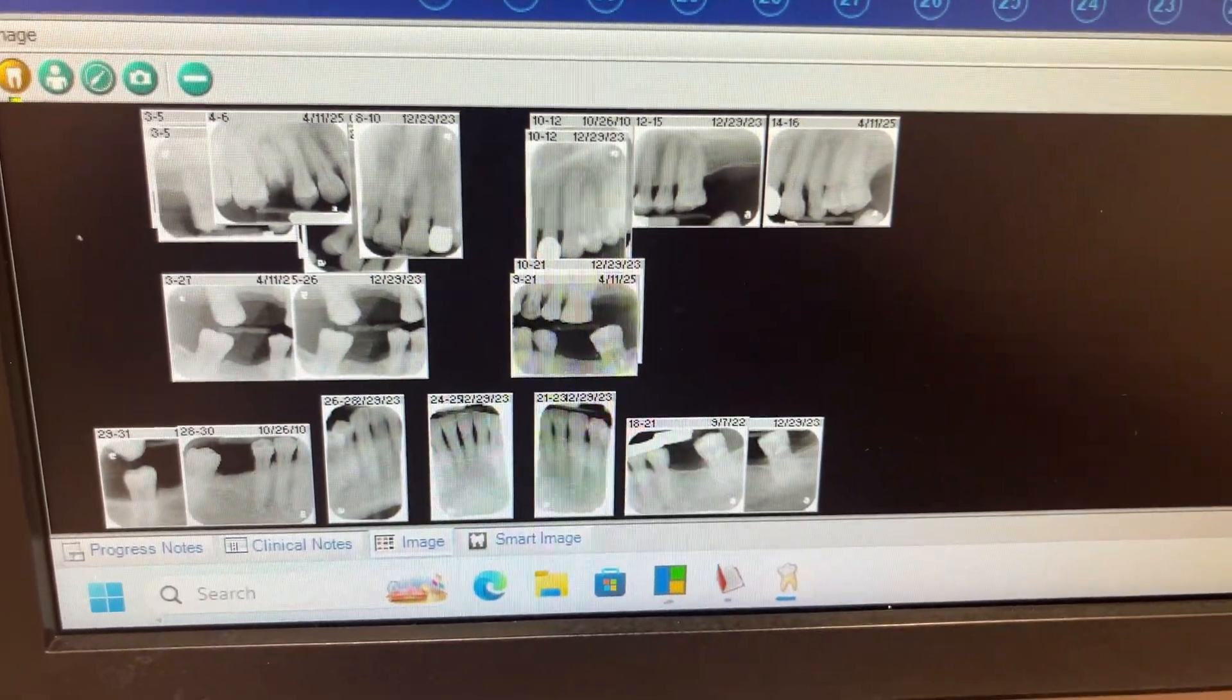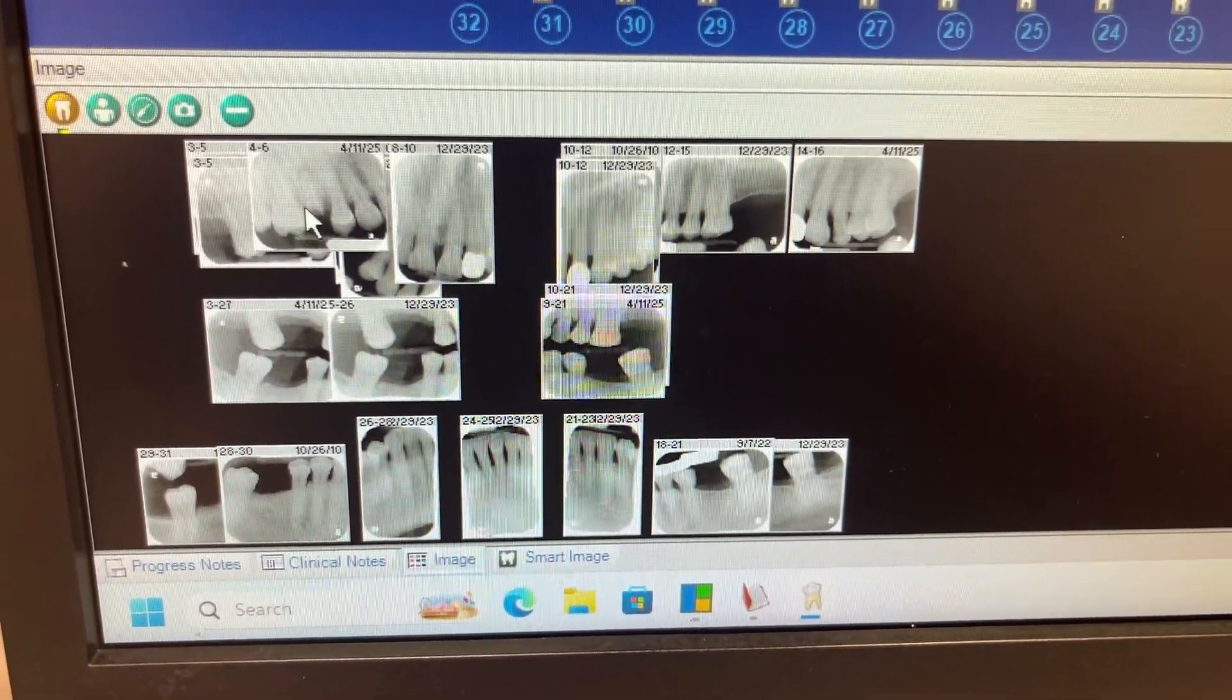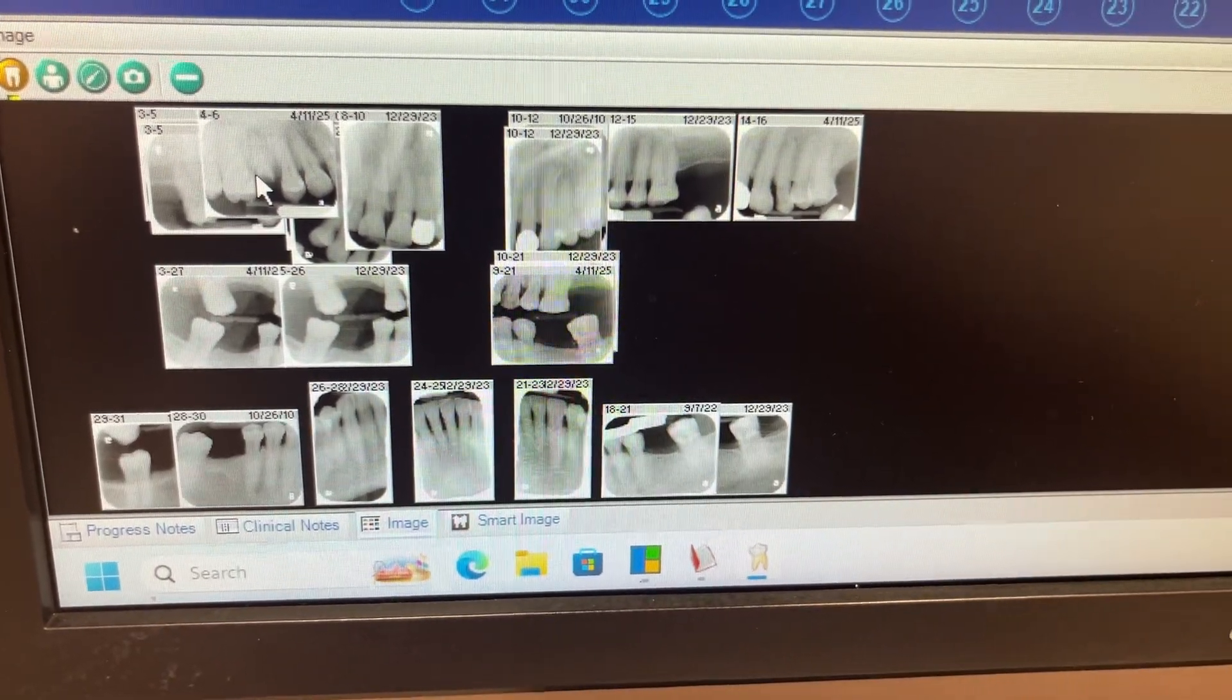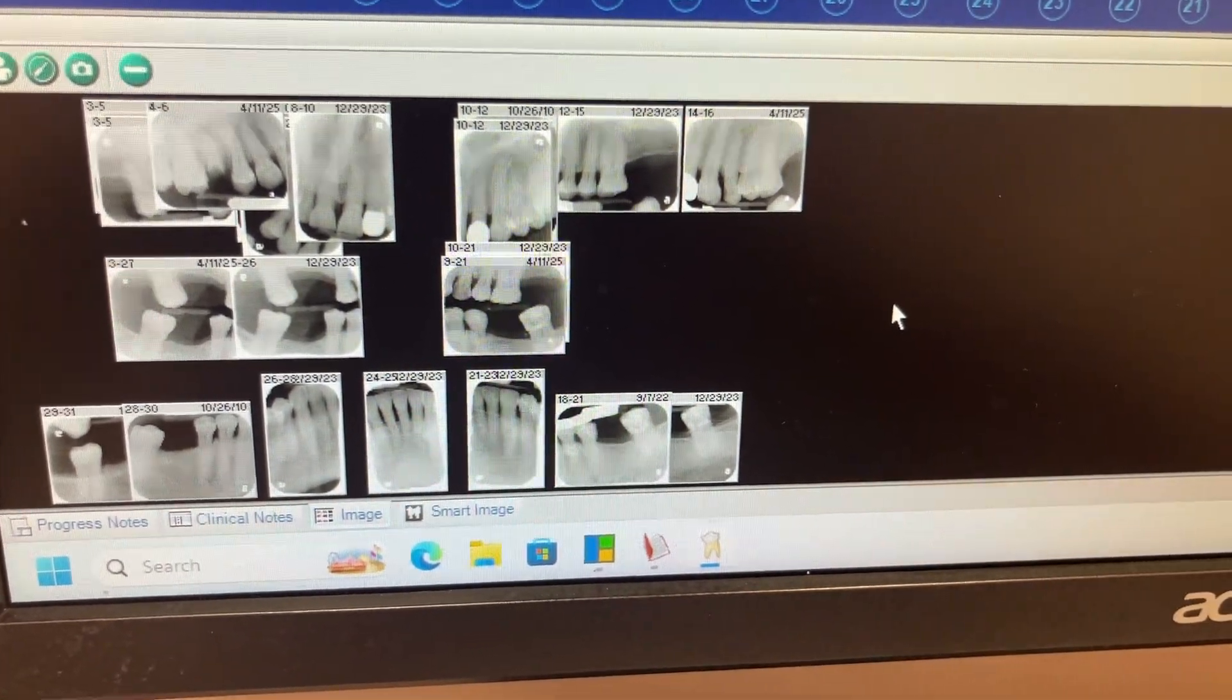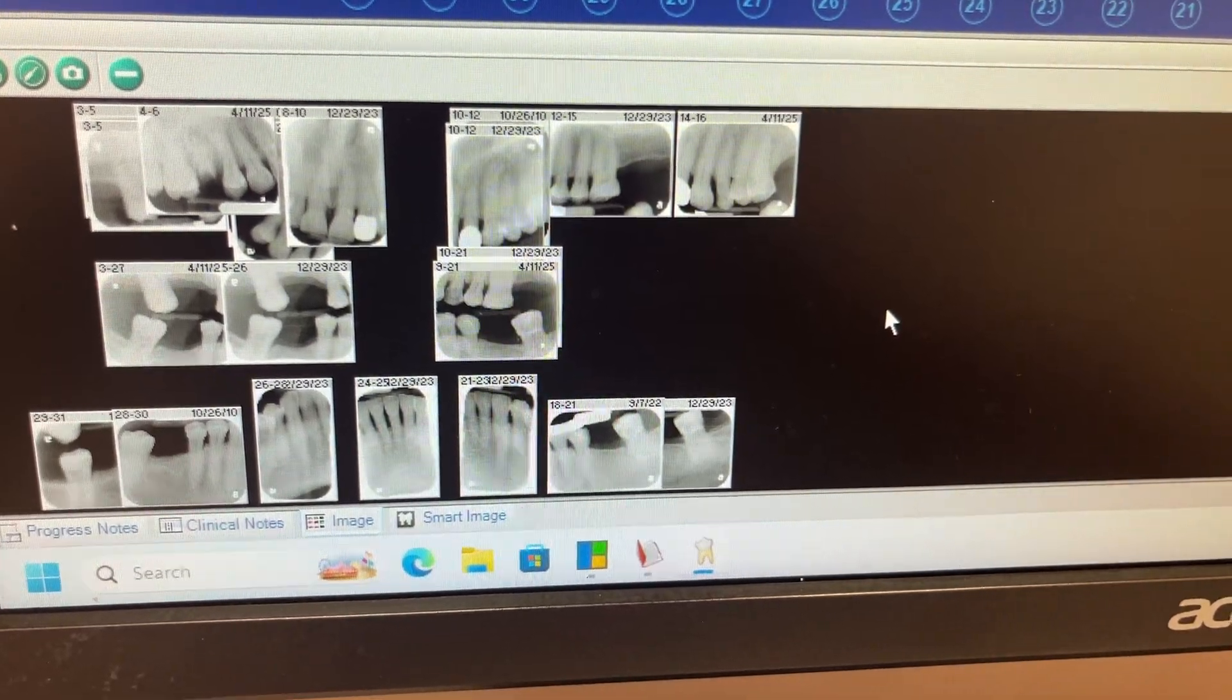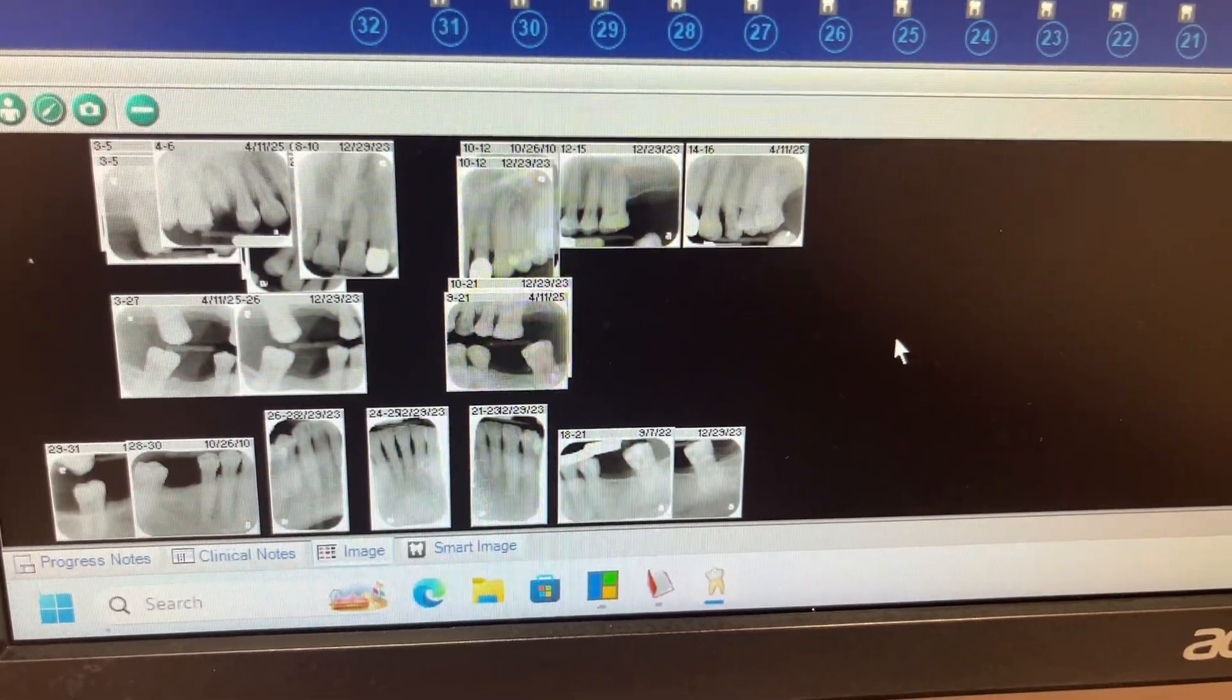Hi guys, it's me, Asherita C, aka The Traveling RDH. Today I'm going to show you how to export an image from another chart into a different chart. So if you accidentally put it in a patient's chart that it's not supposed to be in, but you need to move it to a different chart, this is how you're going to do it.